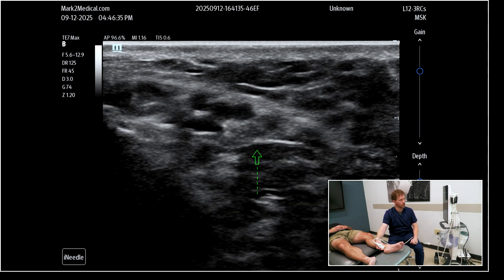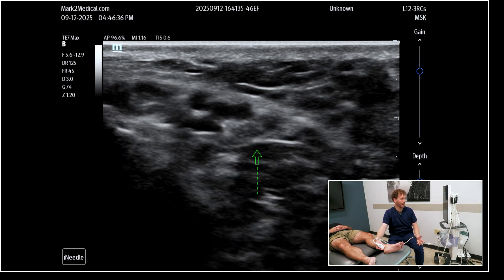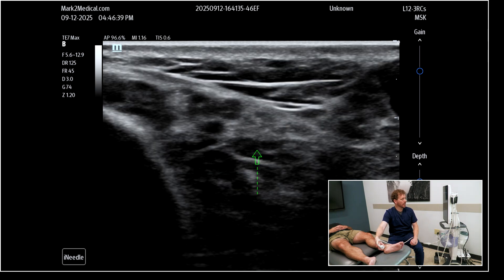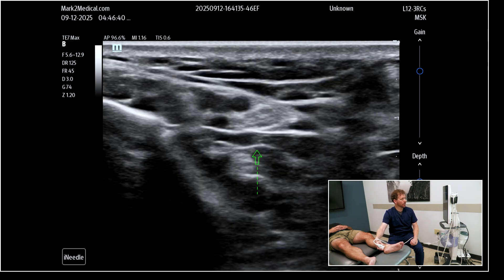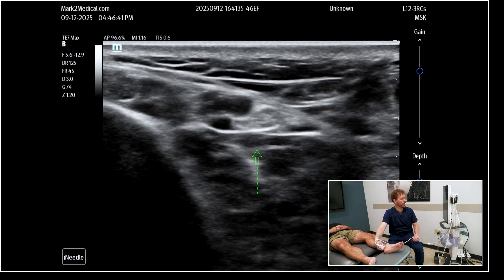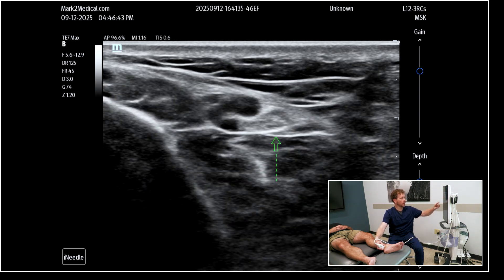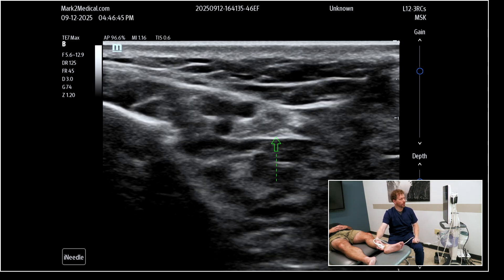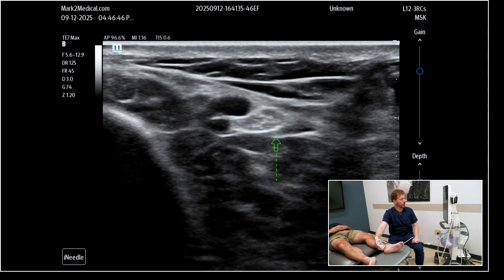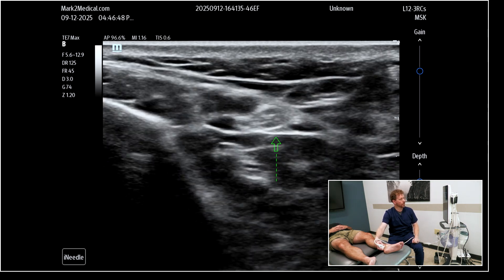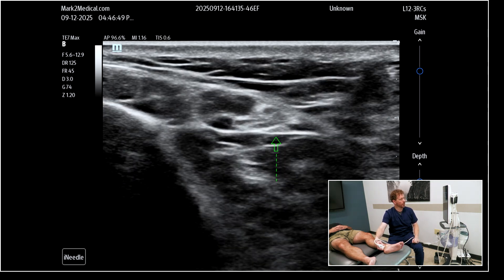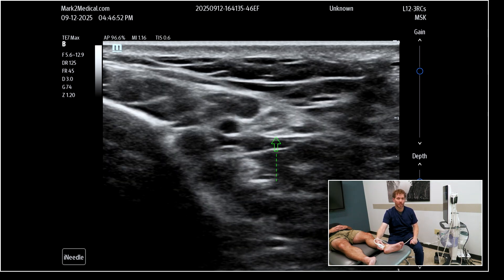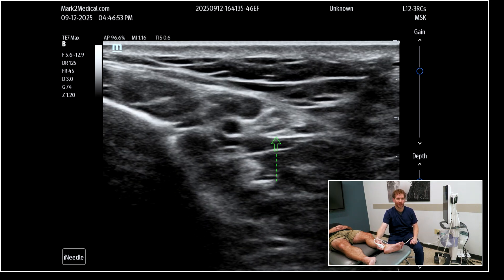If you placed your probe down in that position, you'd say, 'I don't see a nerve anywhere.' So one of the ways we can identify anatomical structures, especially nerves, is just with a little toggle of the transducer to see where we can make that nerve show up a little bit brighter. Hope that's helpful — we'll see you at the upcoming conference.